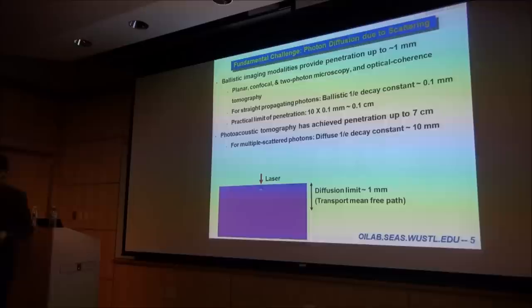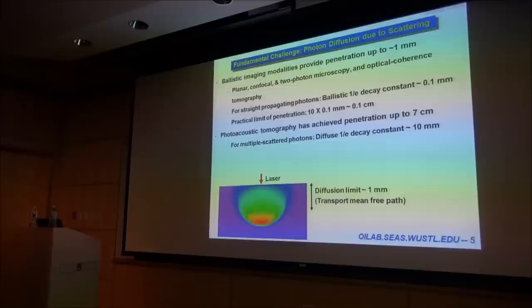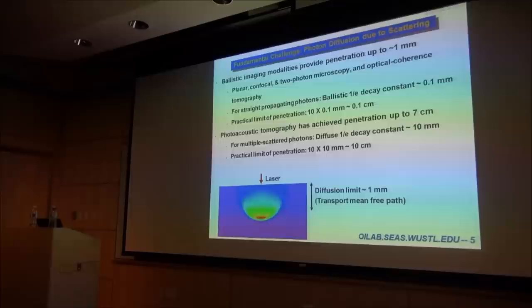The scattering dominates absorption, in fact, in the photon propagation process. Okay? So if you tolerate scattering, the absorption isn't too bad. The 1/e decay constant can be increased to multiple millimeters. You multiply that number by a factor of 10, you can potentially reach about 10 centimeters. So that's the power of this technique.